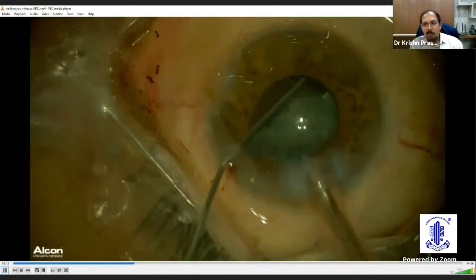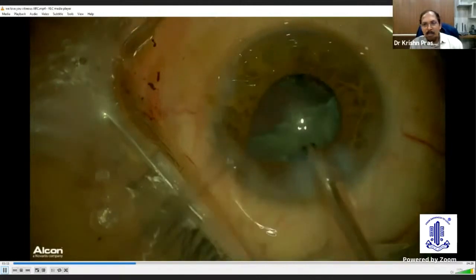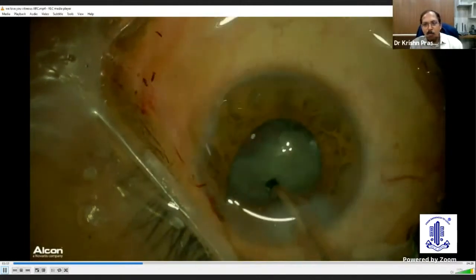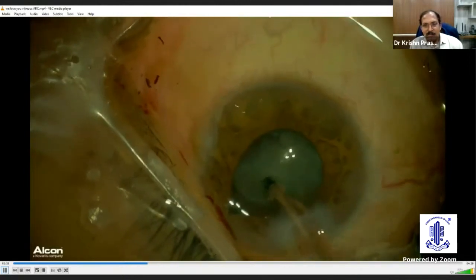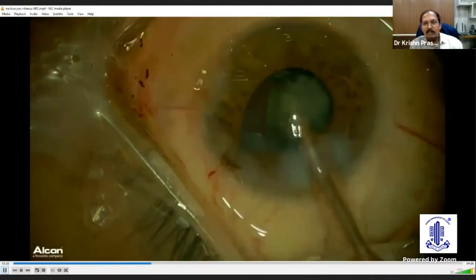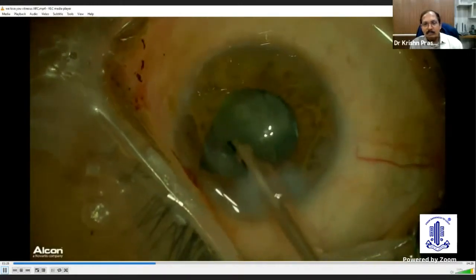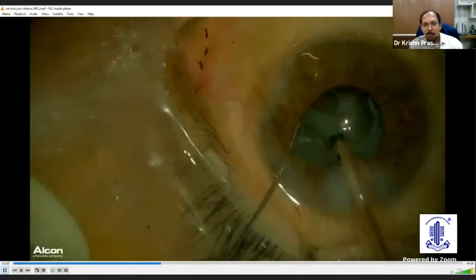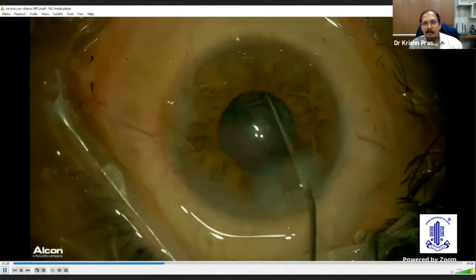He takes a premium viscoelastic and plugs that hole. Now he has a platform on which he can continue to emulsify the rest of the nucleus very comfortably. With that viscoelastic seal, the vitreous is at the back. The viscoelastic bridges the gap and creates a platform.